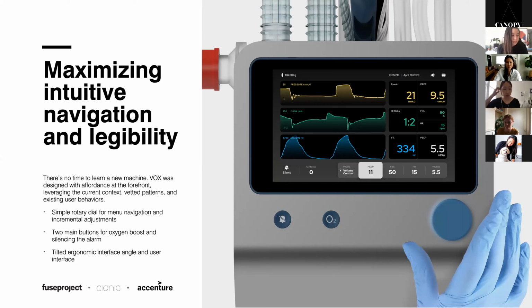Yeah, so when we think about the interaction with the ventilator, we really wanted to make sure that we're not introducing a new way of interacting with the ventilator, using what's existing in the market. Therefore, we chose the rotary dial for the menu. So very simple. That's how you can confirm and move to the menu. And also the two physical buttons on the left are for the oxygen boost and silencing the alarms.